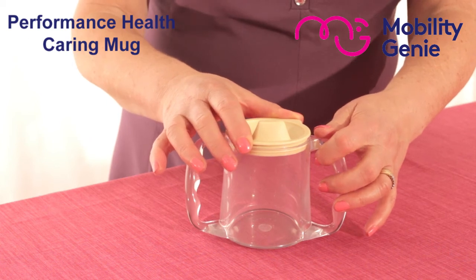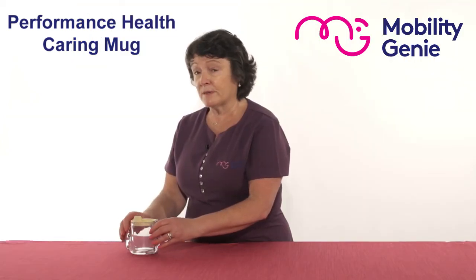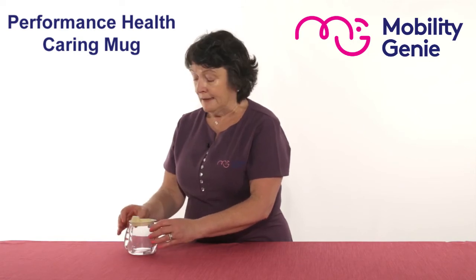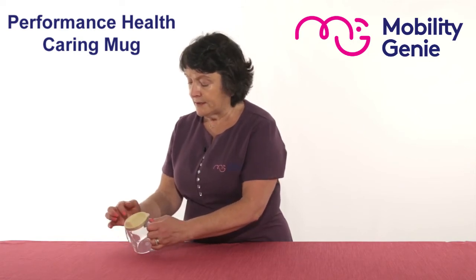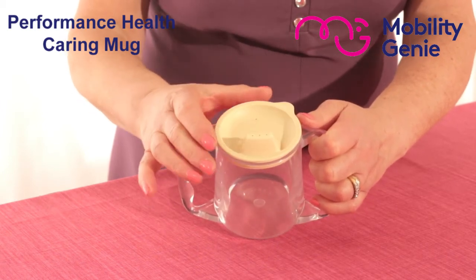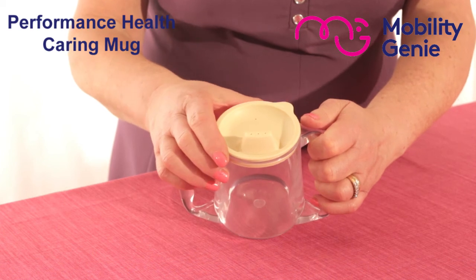It's suitable for people with a tremor, but the person would have to be able to support the weight. The lid is very well designed with a spout that has three little openings — three little holes — that allow for easy flow of clear fluids.